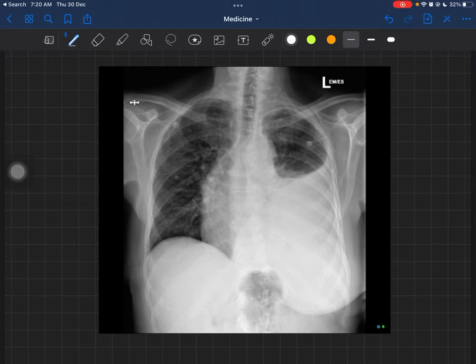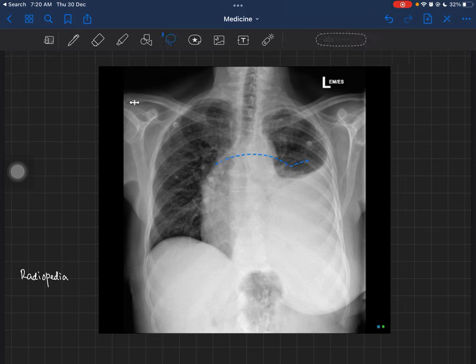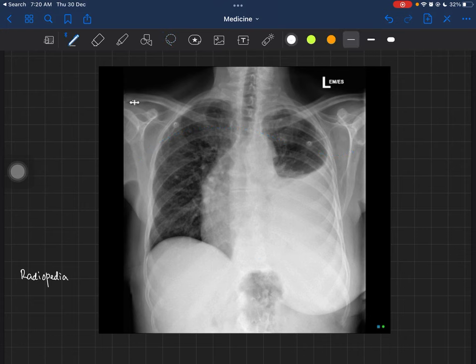Hello everyone. In this video we are going to learn how to read a chest X-ray. This X-ray is probably of a lady — I've taken it from Radiopaedia. This is not for the purposes of diagnosis or treatment; this is just a simple guide for third-year and final-year medical students who are appearing for their exams.